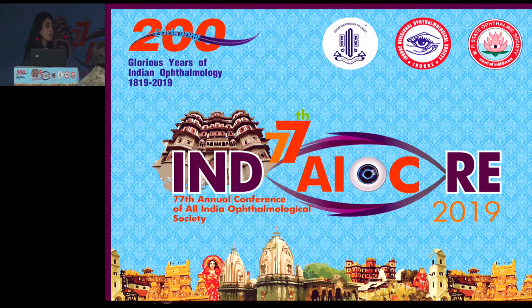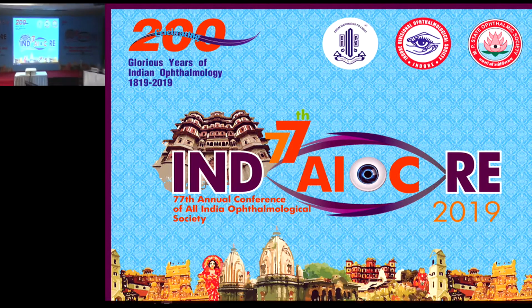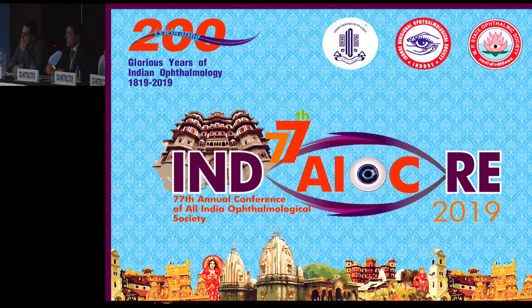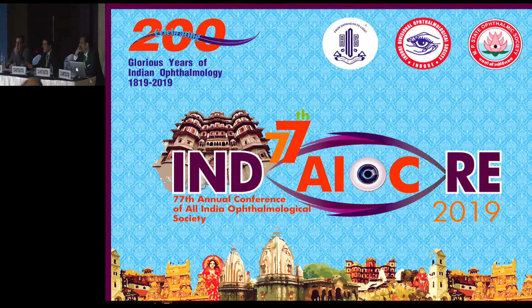So, Manpreet, you have been doing OCTA with fluorescein angiography. Would you say that fluorescein angiography is no longer required and you can go ahead and treat your patients purely on OCTA and OCT? When it comes to diabetic macular edema, fluorescein still has a role. A patient walks into your clinic for the first time who has diabetic retinopathy. You don't know if it's DME with PDR. If it's DME, I will still rely on performing a fluorescein angiography. So you will never do an angiogram? Not for DME yet. The patient has walked in fresh.